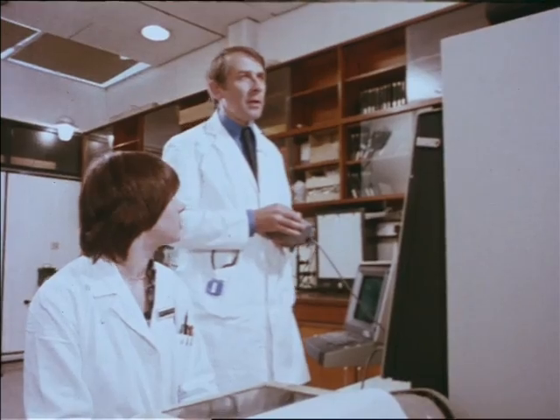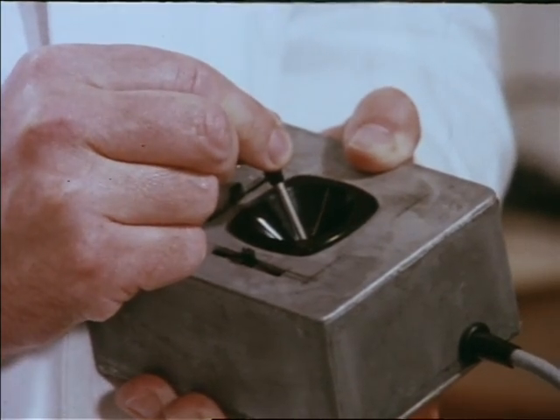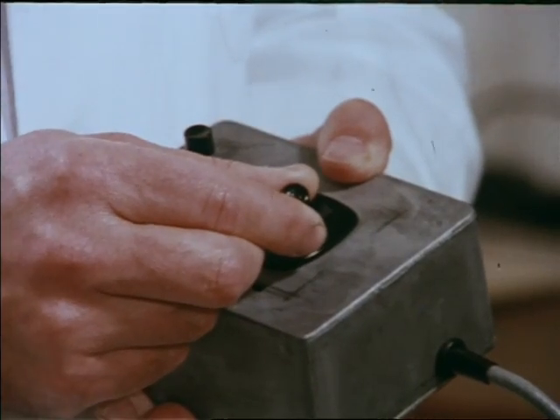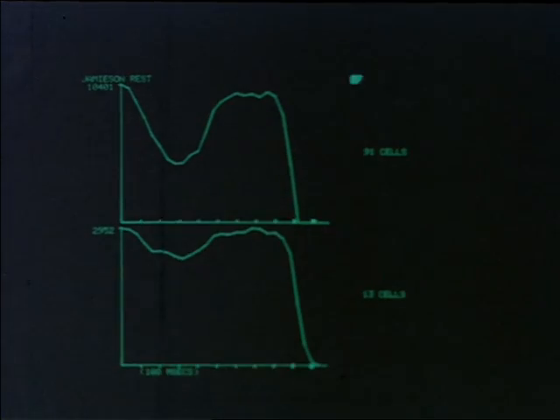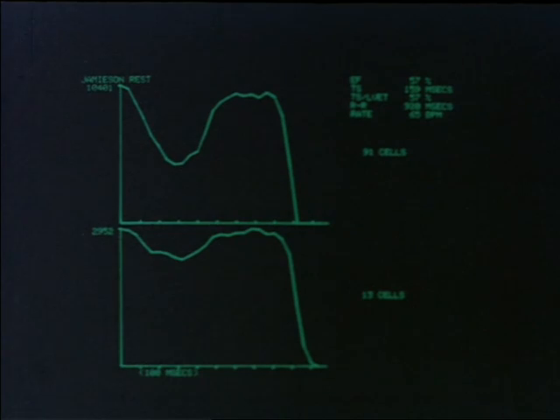Okay, Gina, we'll just run it down there. The image itself provides the answer. Sure, that's the interventricular septum, quite clearly marked there, so we'll come down there first. A line is drawn around the left ventricle. We'll go around the bottom edge, and that's quite nice there. Okay, and up there. Exactly how much that yellow area changes with every heartbeat can now be calculated. Okay, that's it. It's a measure of the ventricle's efficiency as a pump. The result is plotted out, an image of the efficiency of the heart at work.